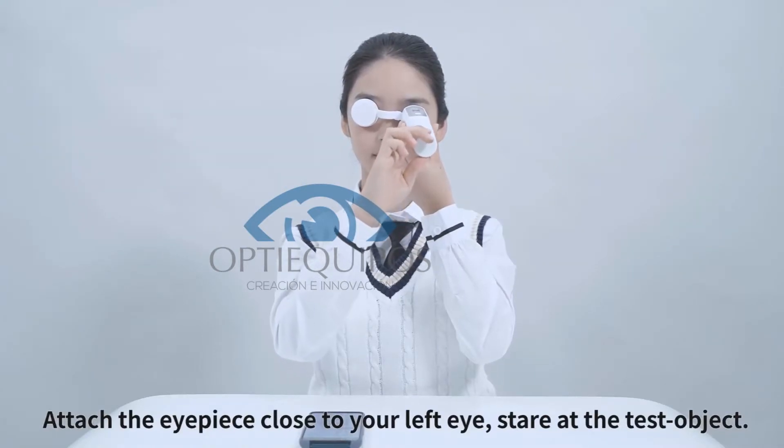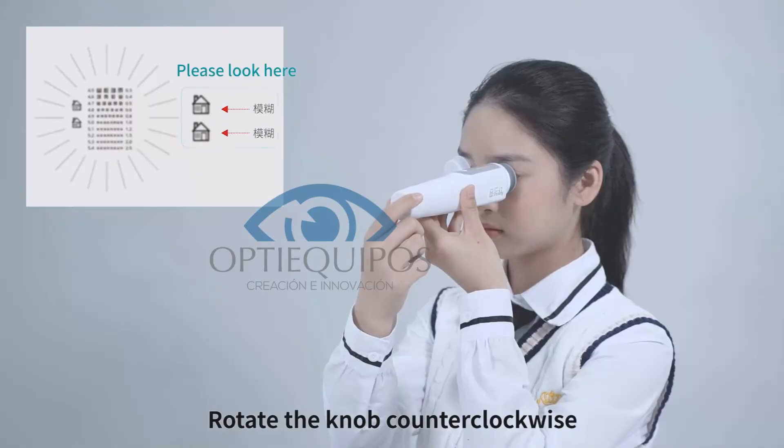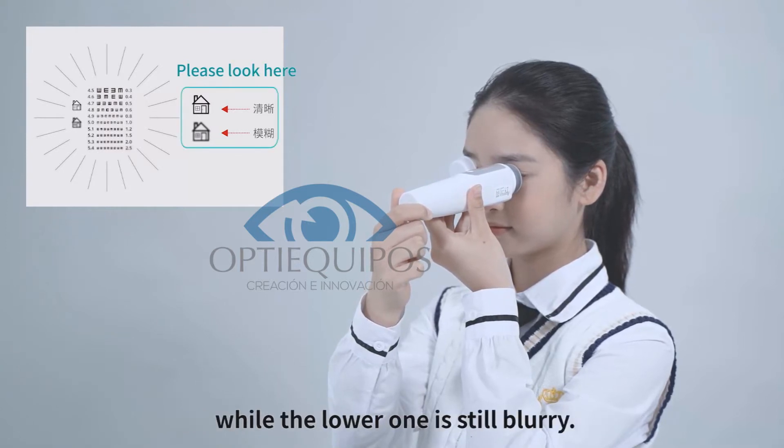Attach the eyepiece close to your left eye and stare at the test object. Rotate the knob counterclockwise until the upper house icon appears to be clear while the lower one is still blurry.